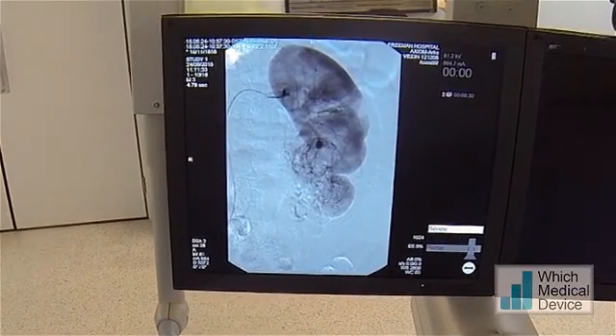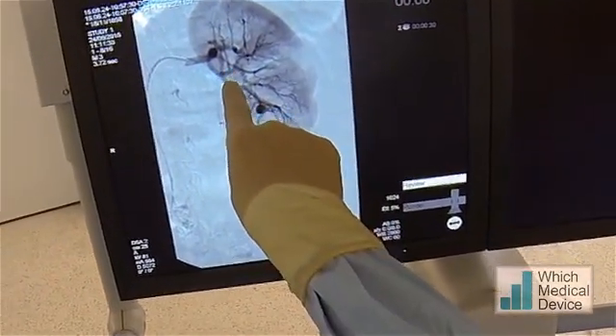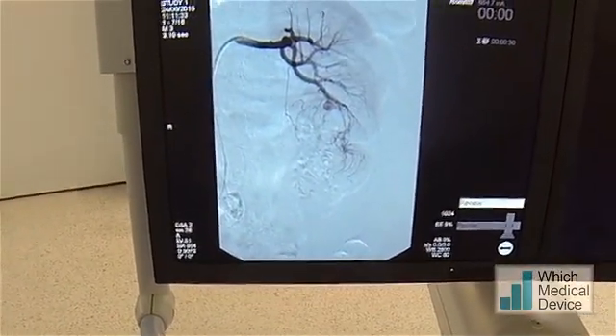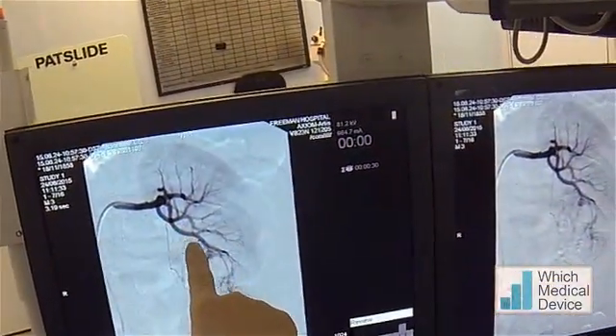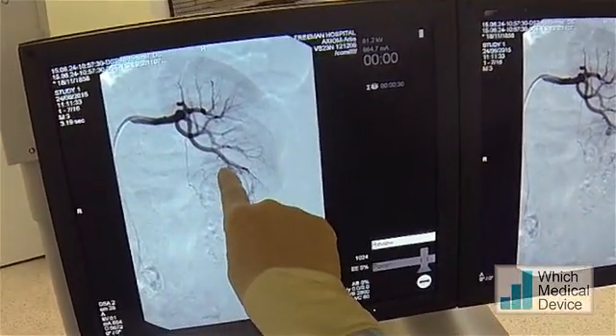They all seem to be supplied by this vessel here. Let's go back one image - let's see where that's coming off. So it's coming off here, there's a trifurcation, and it's going down, and we've got some smaller vessels here and an aneurysmal segment there.